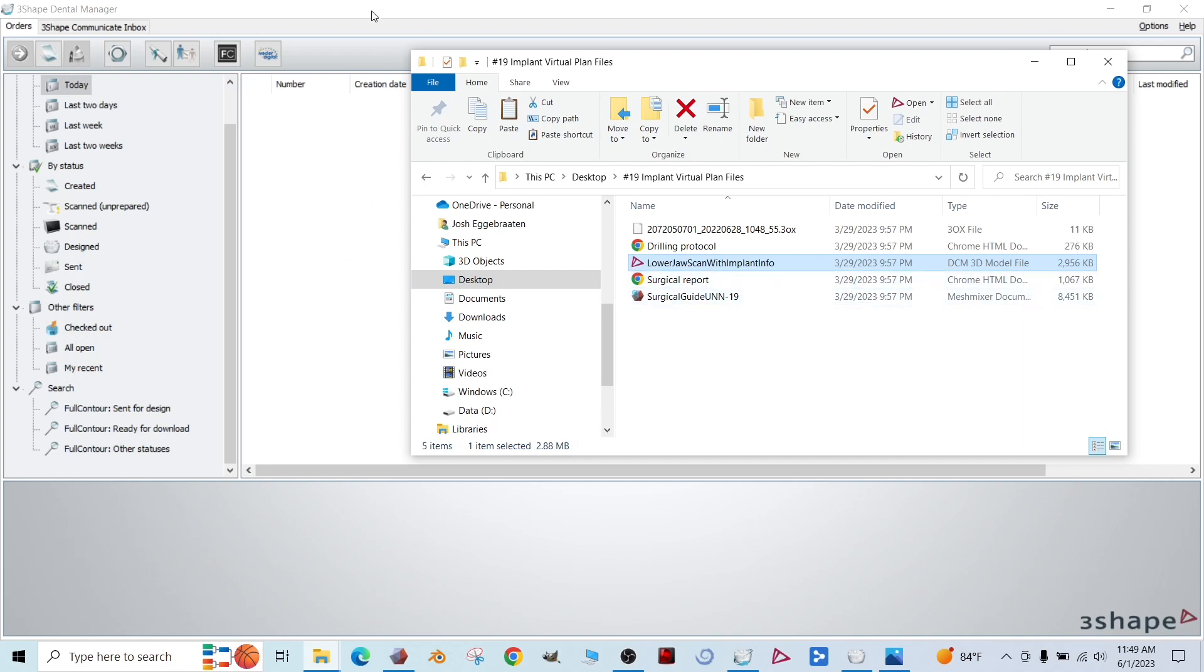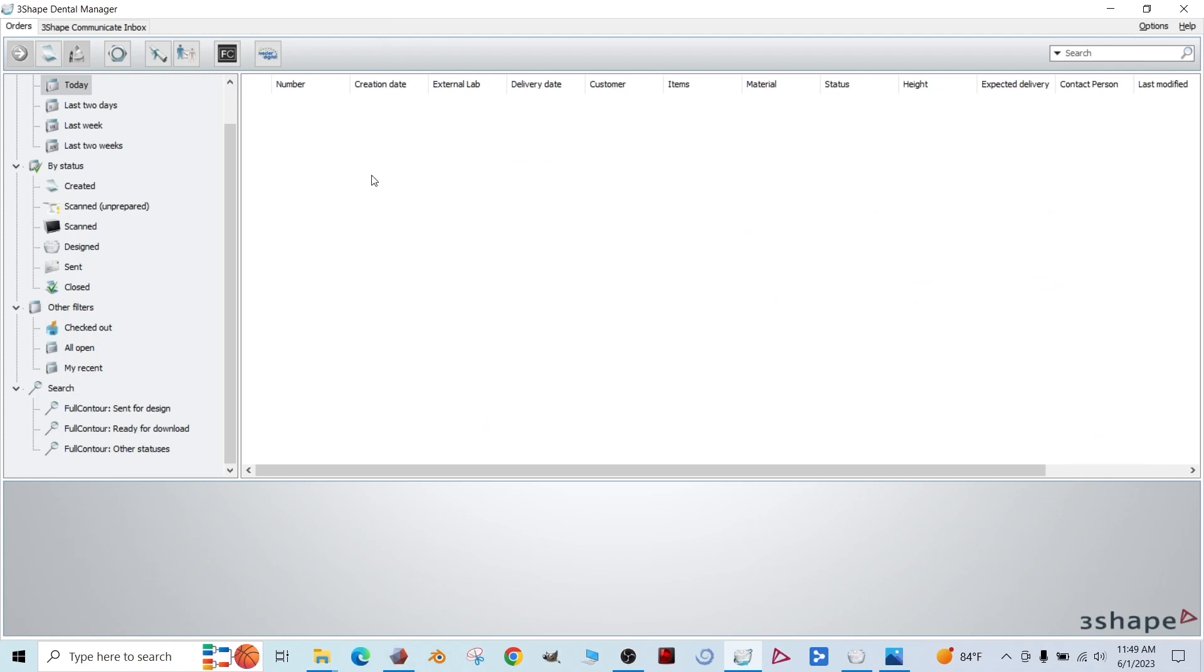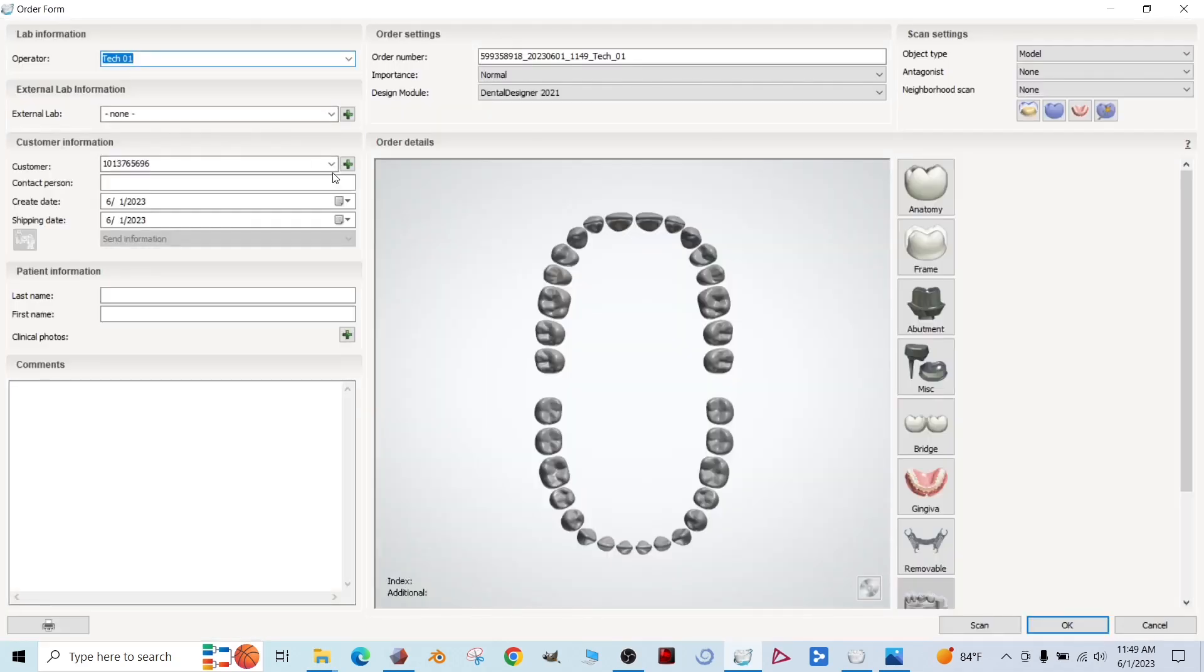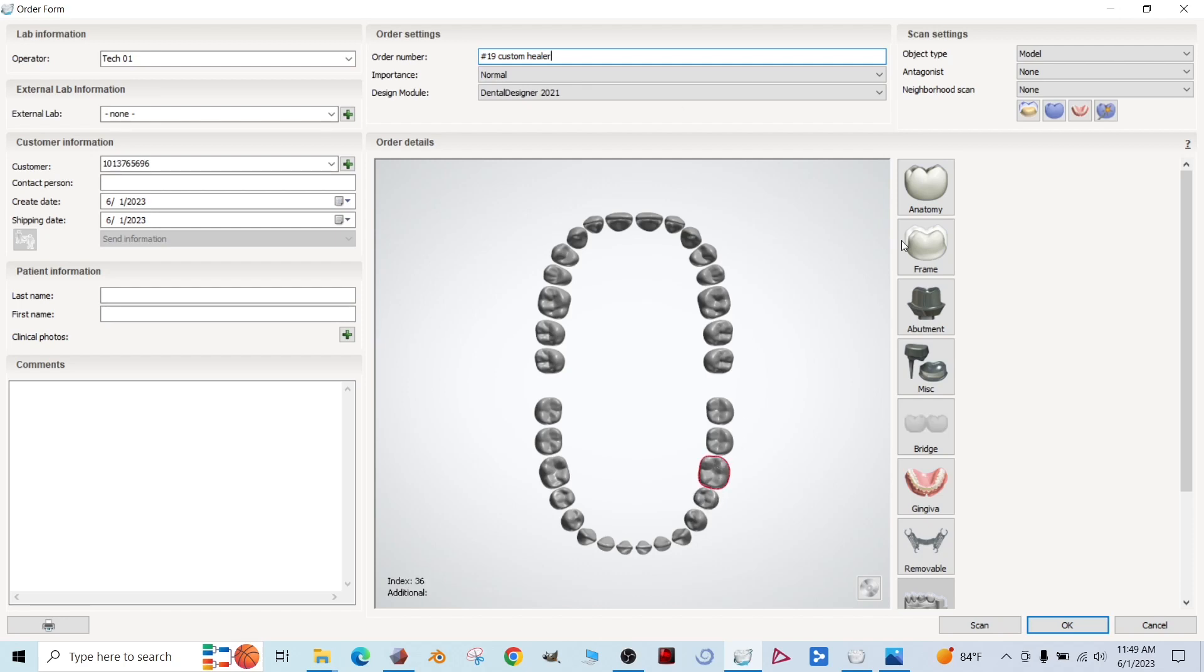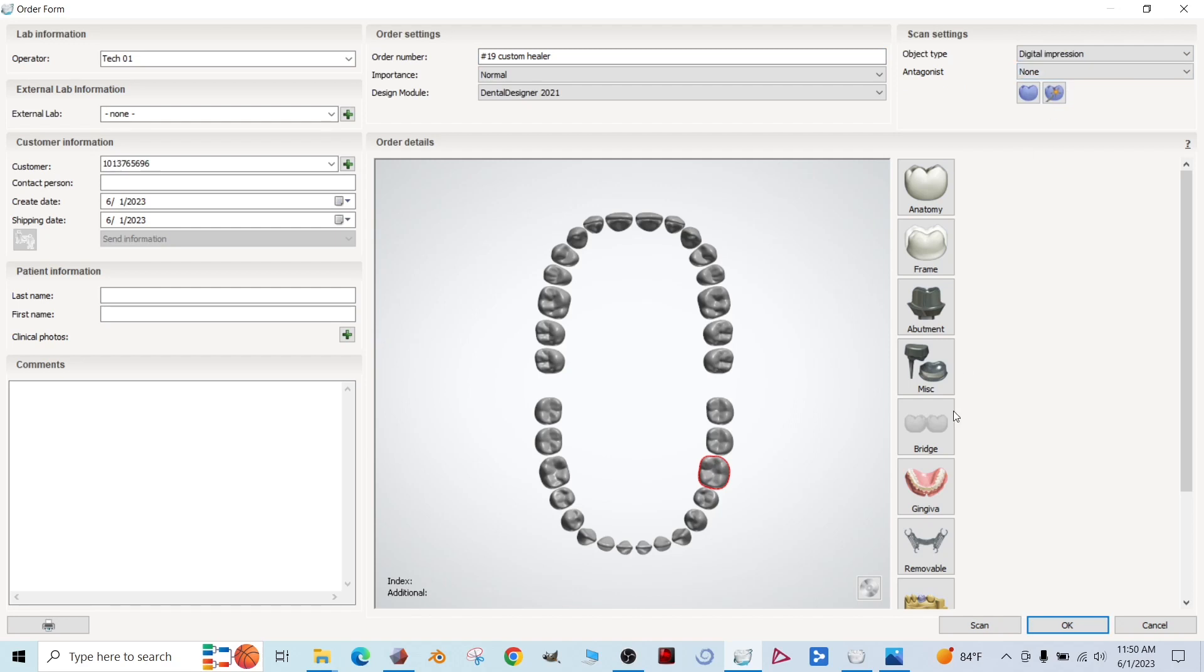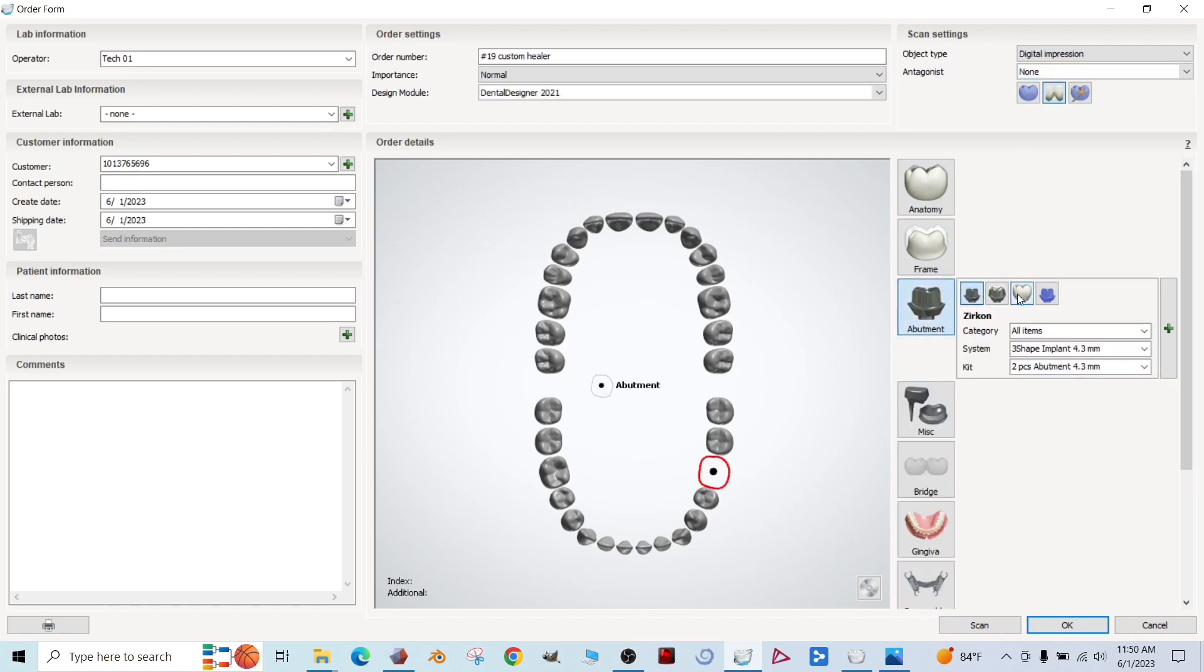So I'm going to navigate to 3Shape and we're going to make a new order. And let's name our case. Select our tooth number. Object type. We're using a digital impression. And then we want an abutment.